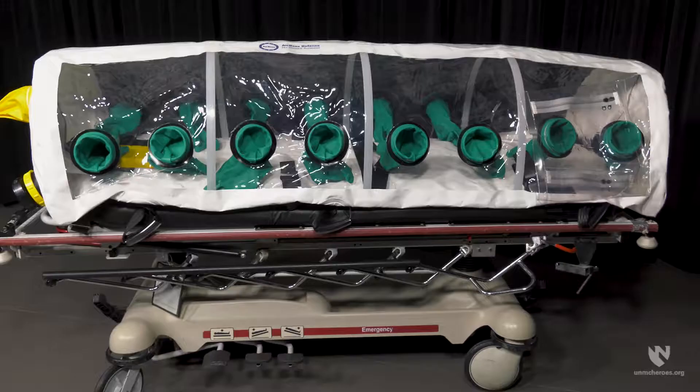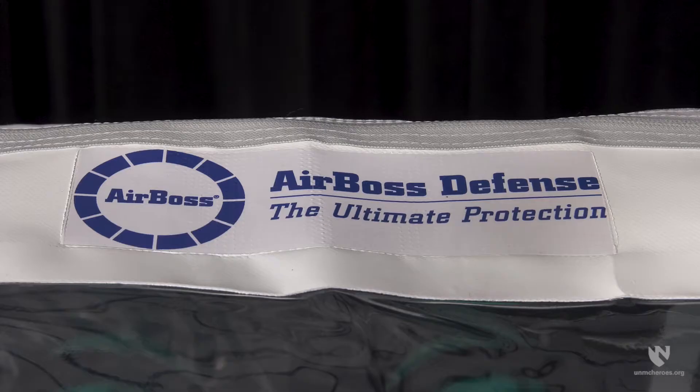Since recording our previous videos on the isopod, there have been some significant updates to its design, although the basics of the unit remain unchanged. The first thing to note is that the isopod is now manufactured by AirBoss Defense, who acquired the previous manufacturer in 2015.